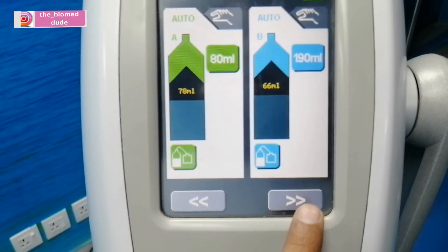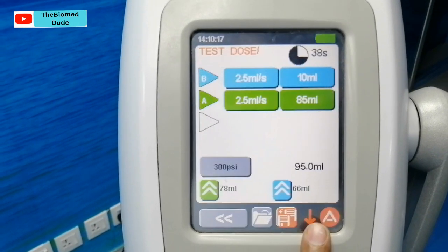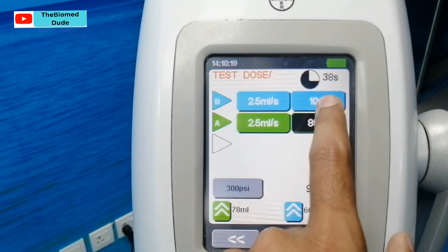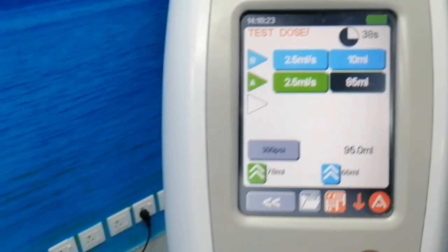The ALT test has passed. Now just press the next switch for the operating procedure. Here it shows 10 ml for the normal line and 85 ml for the contrast. Then press OK.